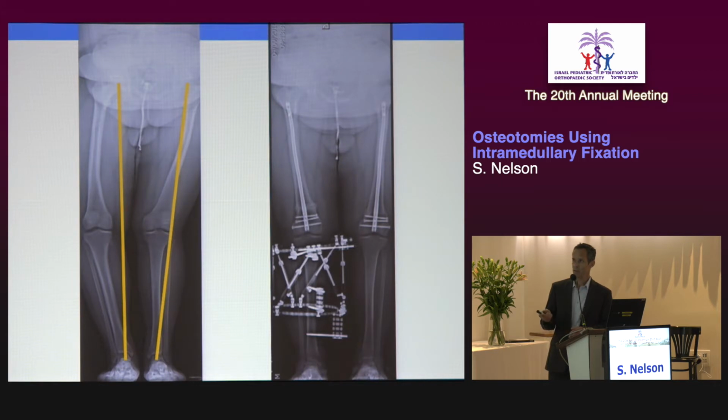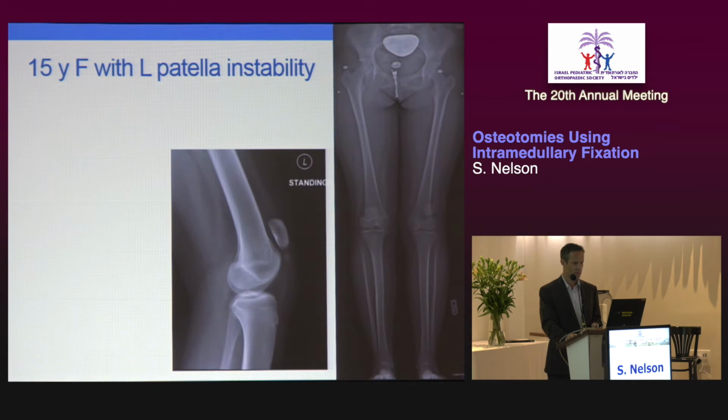This is really helpful to provide a hexapod type of frame on a tibial deformity after doing an intramedullary correction with fixator assisted nailing, because then you can fine tune your correction by adjusting your spatial frame to the exact point that you want and getting your mechanical axis deviation right down through the middle of the knee.